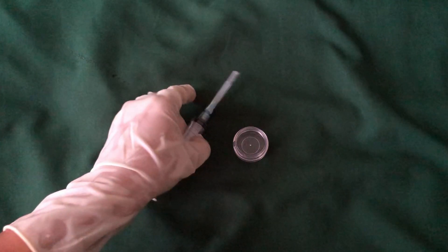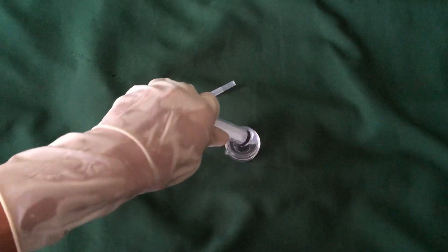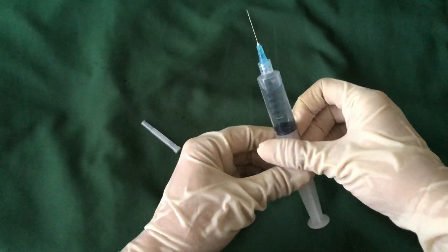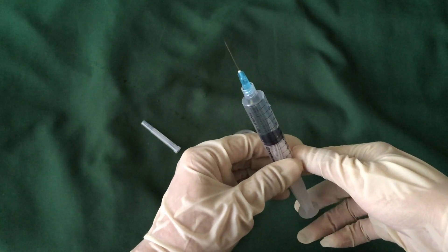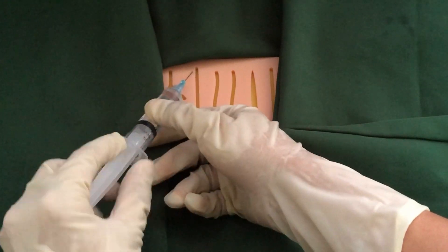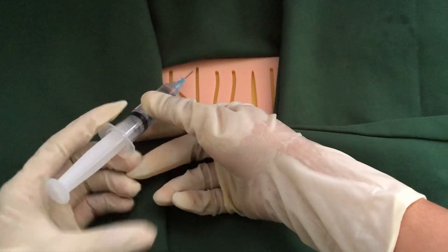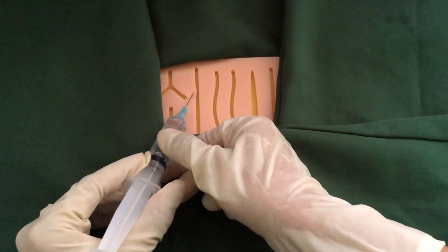Withdraw with the syringe the desired amount to be used. Aspirate anesthetic from the bottle — make sure to always observe sterility. Remove air bubbles from the syringe. Inject with bevel up into the desired area subcutaneously. Always remember to aspirate before injection to make sure no vessels were hit, as there will be backflow of blood.